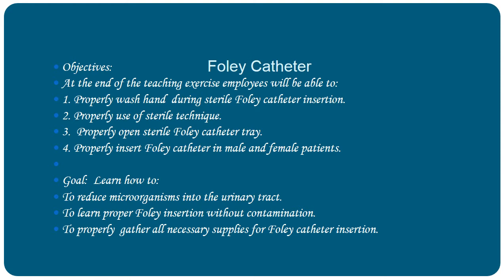Proper hand washing, proper sterile technique, proper sterile opening of supplies, and proper insertion are all important. The achieved goals should be reducing urinary tract infections, better known as UTIs, inserting Foleys without contamination, and also properly gathering all the necessary supplies.